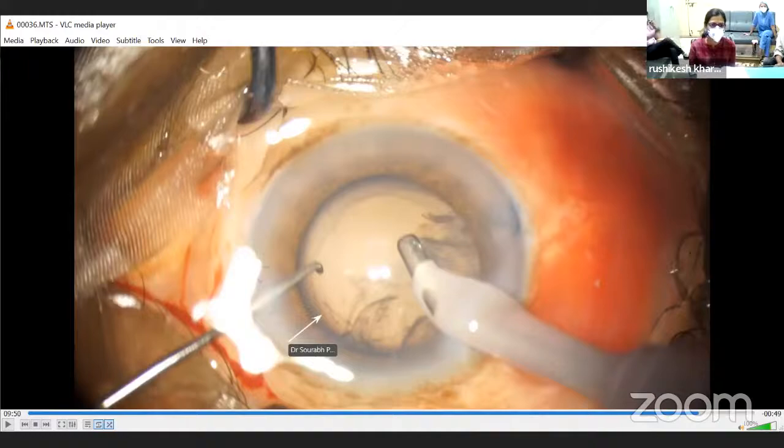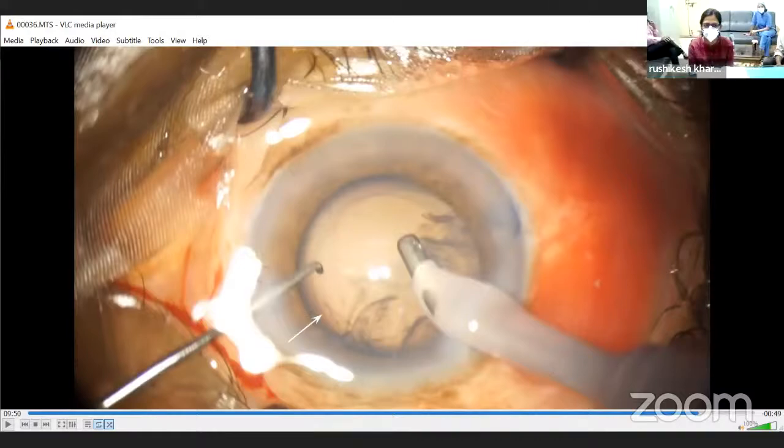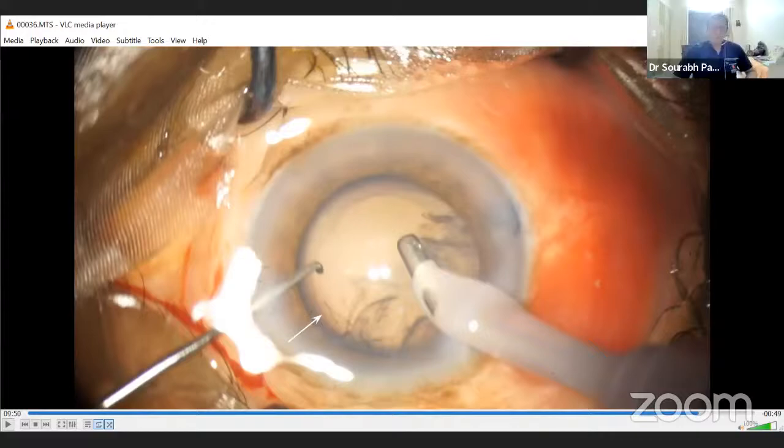If it is far away, basically, if you can see the mouse here, a little bit away from the main incision, then this angle becomes a little bit uncomfortable. And sometimes when you are doing either trench divide or chopping, this can cause undue pressure on this part of the nucleus or bag, and can cause tilting of the lens to that side and can cause dialysis. So I think 90 to 100 degrees is the right angle between the main incision and side.